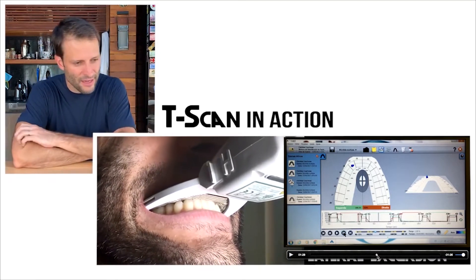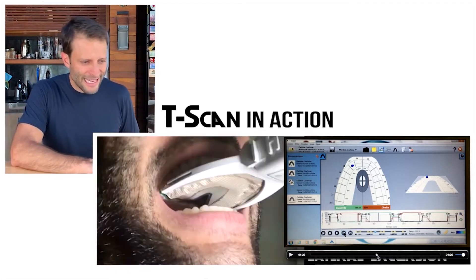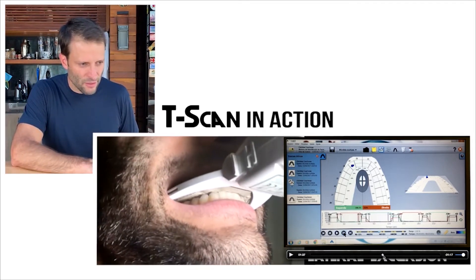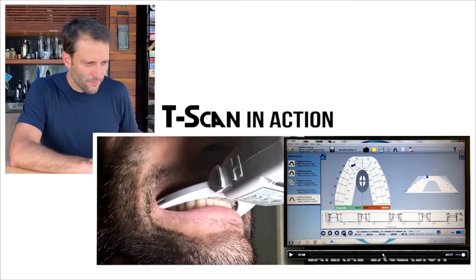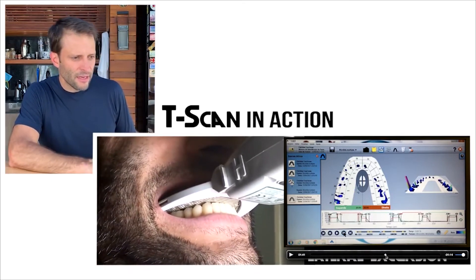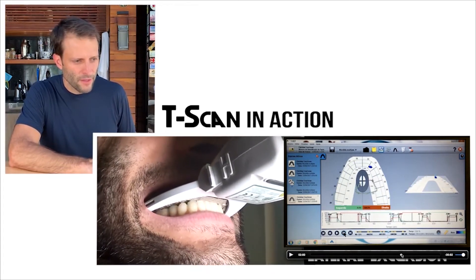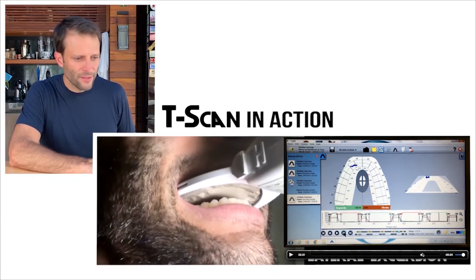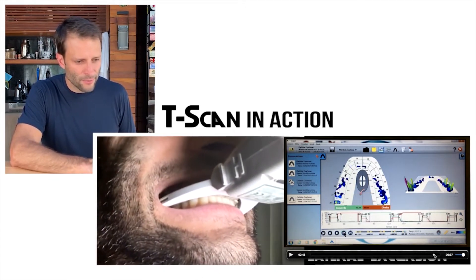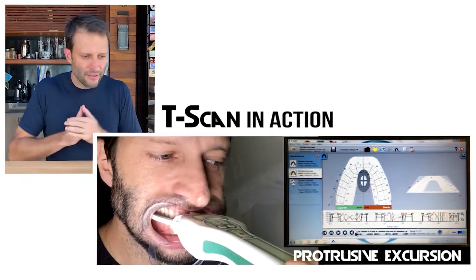On my left side, even more striking — a hundred percent of the load as I slide to the left is on my lateral, a little bit on the central. If I squeeze, I can touch the canine a little bit, and then back to full occlusion. Slide to the right and slide to the left — you do that repeatedly a couple of times so you can identify the pattern.